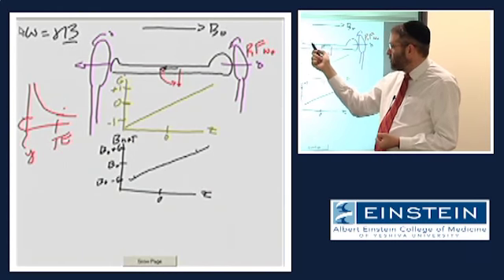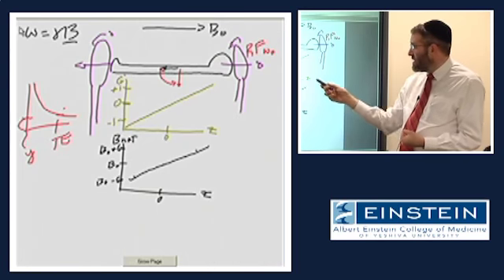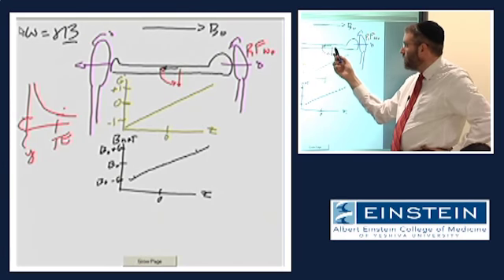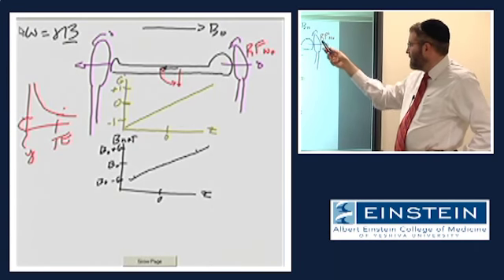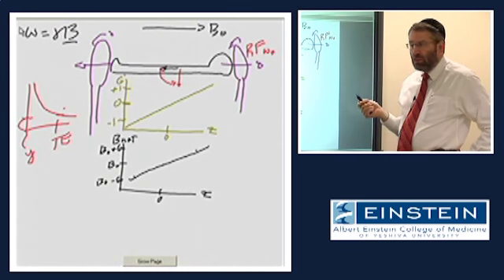But in order to actually generate any signal, right, signal is net transverse magnetization. The spins have to have undergone this flip of their magnetization. That's only going to occur if there was resonance between the precessional frequency of those spins and the RF at the time that we turned the RF on. Okay?